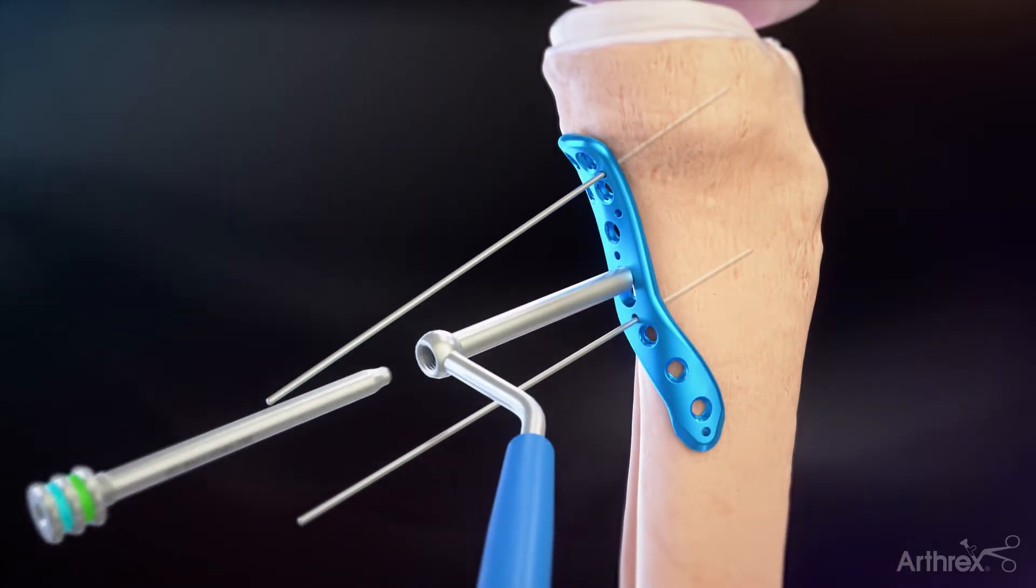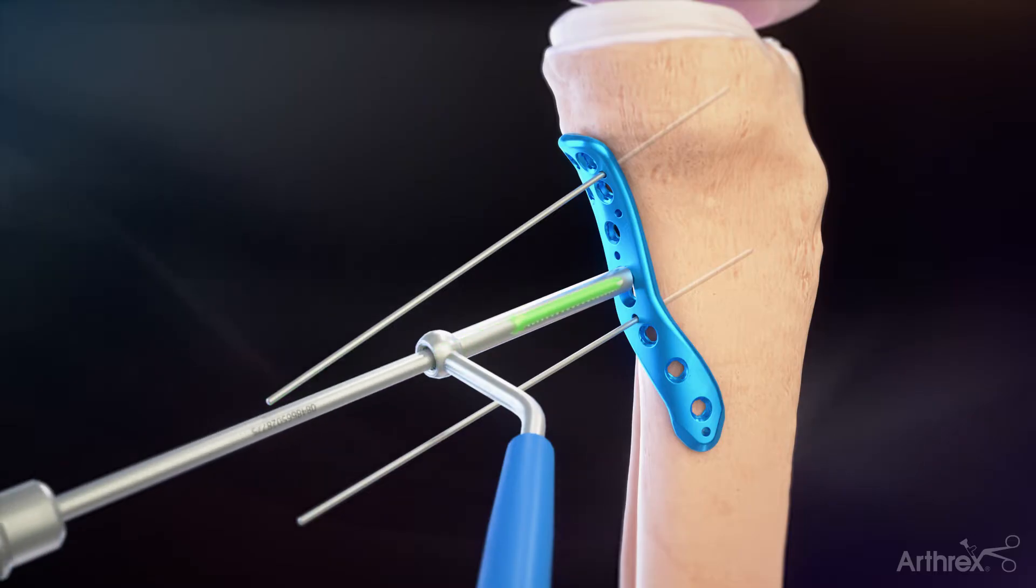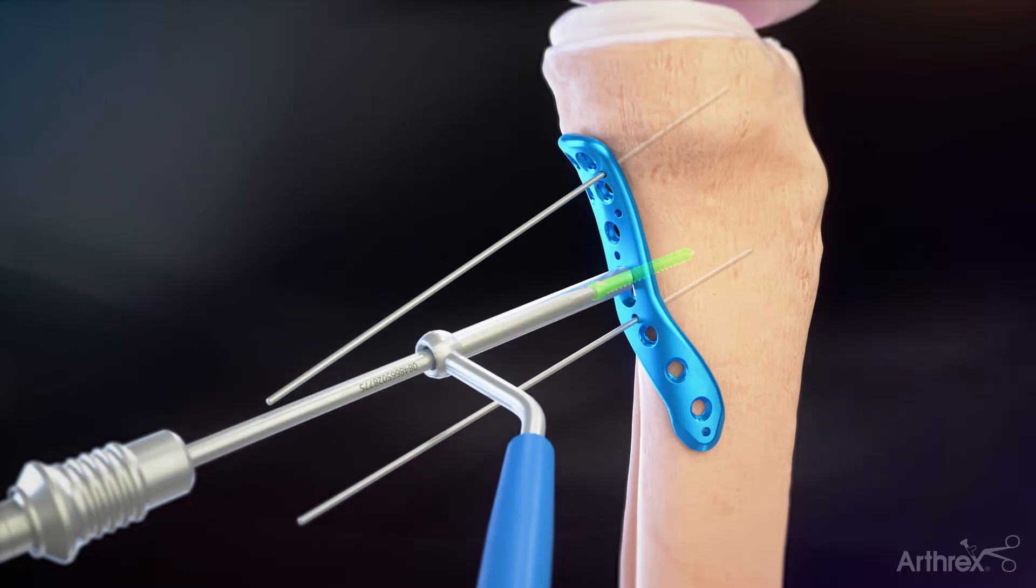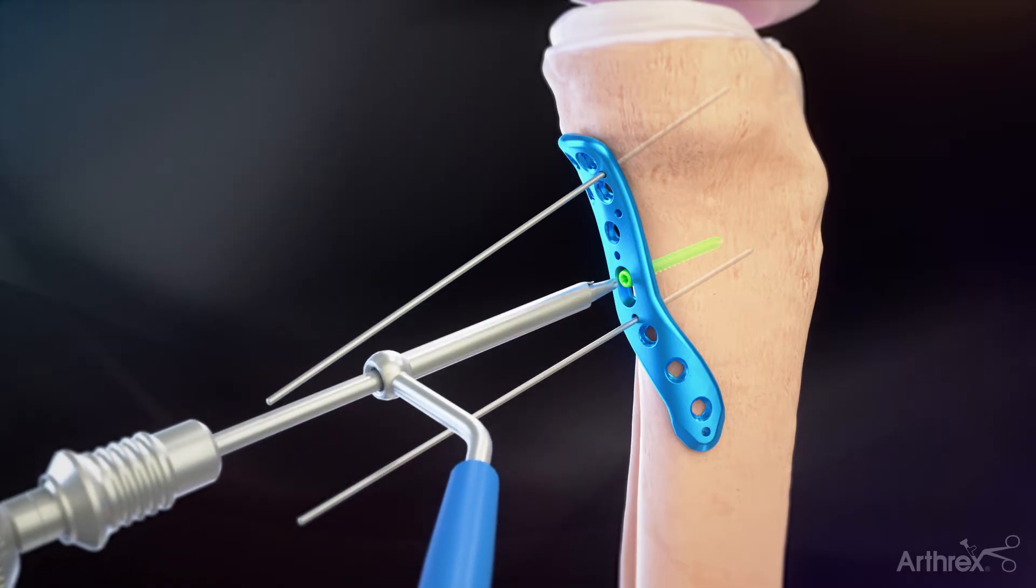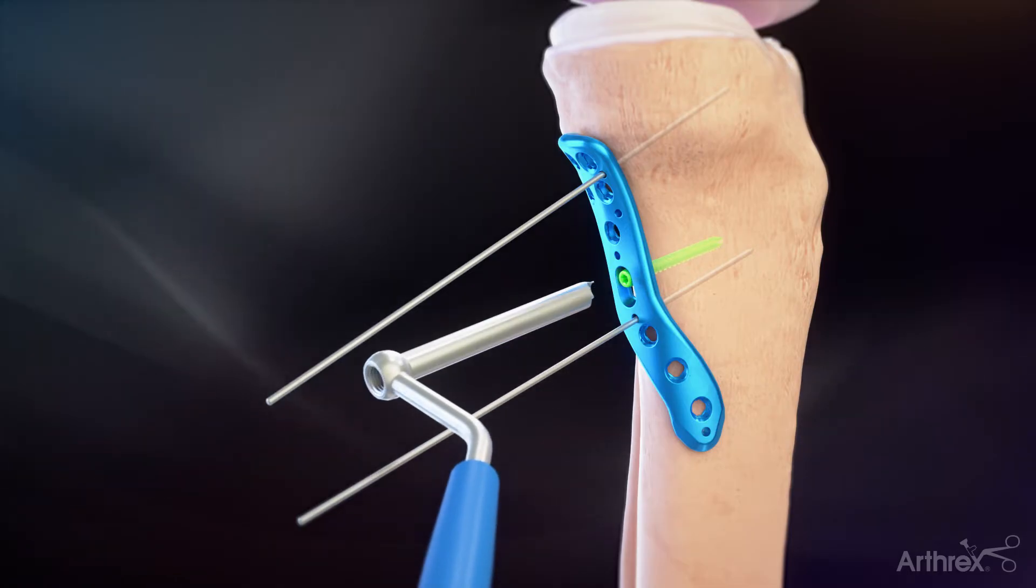Unthread the 2.8 mm drill guide from the screw sheath. Pass the selected screw on a T10 driver through the screw sheath and insert into the bone. When close to the plate, pull back on the screw sheath so it doesn't get trapped between the screw head and the plate.